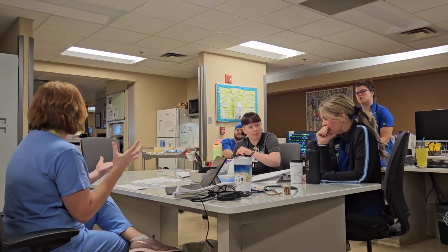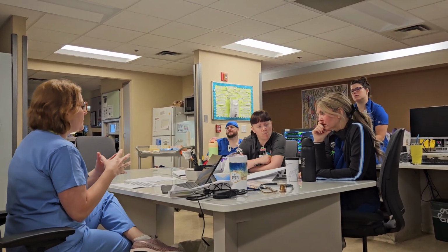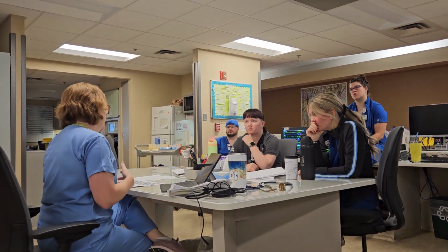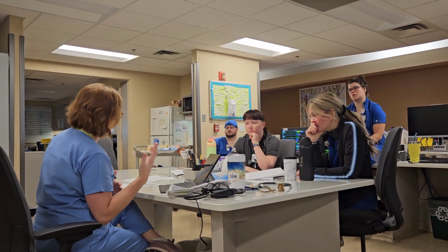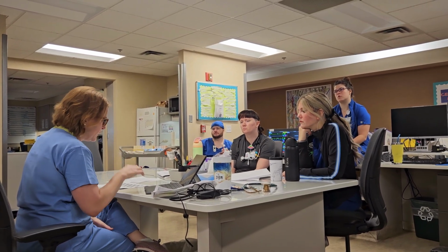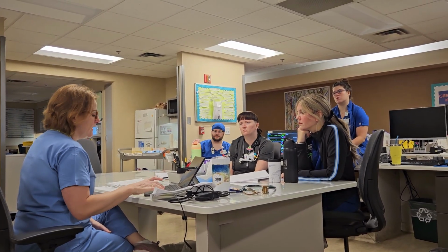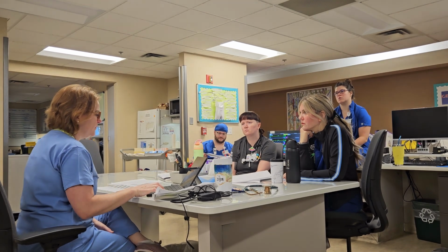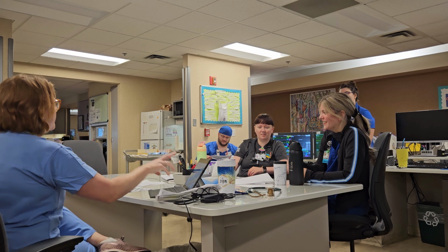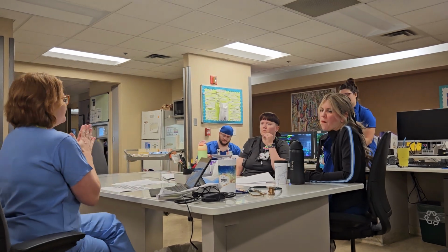That's usually fine, unless we're really worried about increased airway pressures such as in ARDS, severe pneumonia, severe COPD, severe congestive heart failure, pulmonary edema, and so forth. I do talk a little bit about plateau and peak pressures, which we can come back to if we have time.